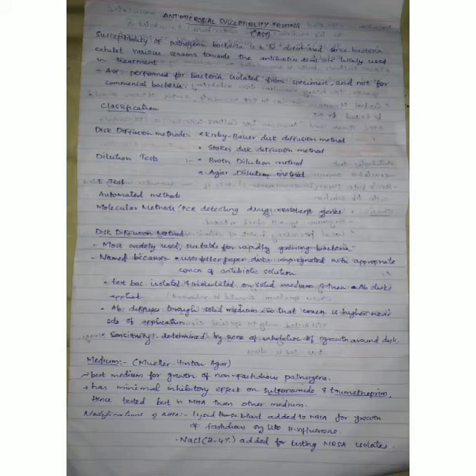So next we will go to the classification of ASTs. It is classified as disk diffusion methods, dilution test, E-test, automated methods and molecular methods. Now we will go into each of these and look at the explanations. First one is the disk diffusion method. This one is the most widely used and is suitable for rapidly growing bacteria, and therefore it is unsuitable for slowly growing bacteria. We will use another method for them.